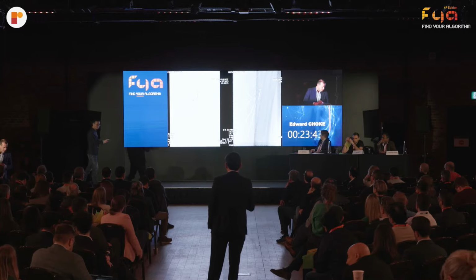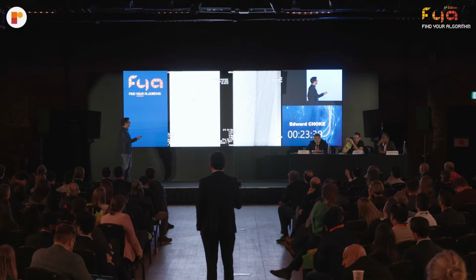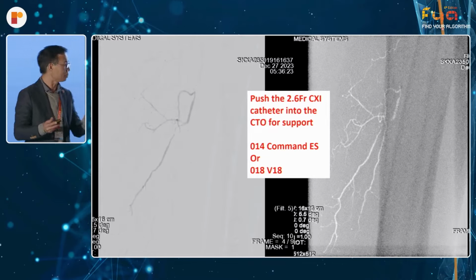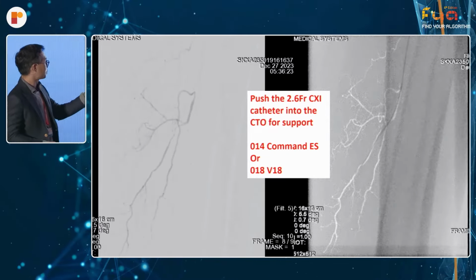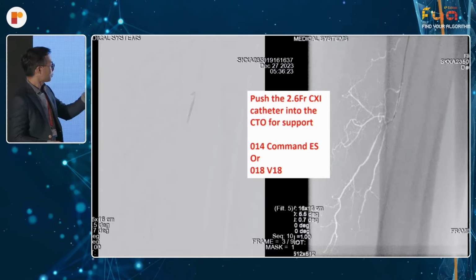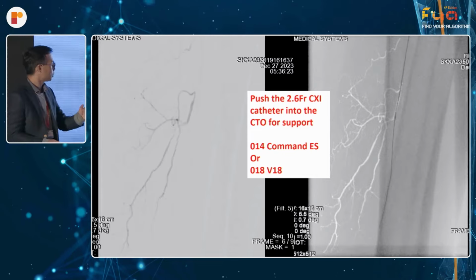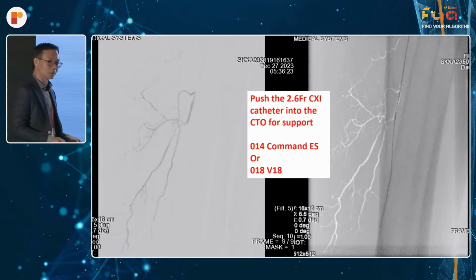So for me, it's the telescope technique, which is my personal preferred technique. With this telescope technique, I first actually will try without using the Bernstein catheter. So it's a very simple step. You've already got your microcatheter in there. So really push the 2.6 French CXI catheter into the CTO cap for support. And I find that a lot of times, you can see it's very subtle there. Once you push it into the cap quite hard, and you push a wire in, either 014 or your workhorse V18, usually you can engage the cap and you will go down like that.